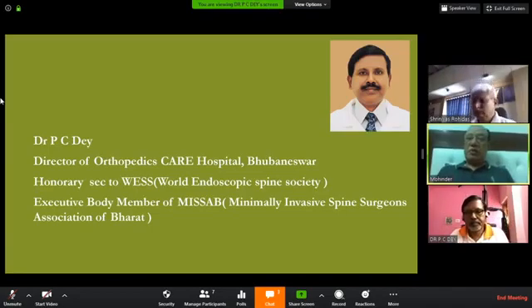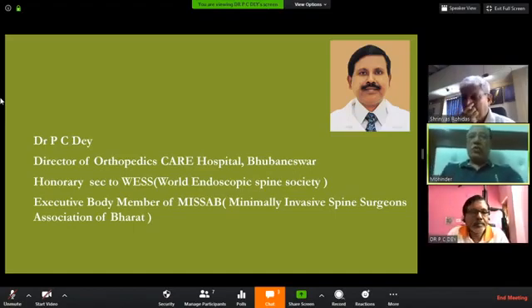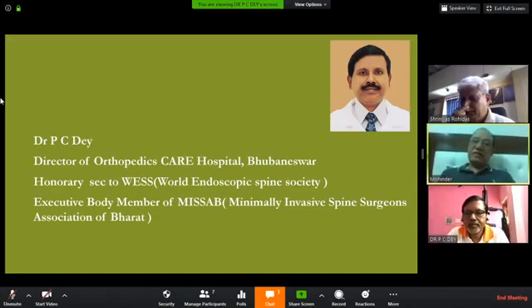First you buy a transforaminal system which is very costly. Then you switch over to interlaminar. So the message for the younger generation is that going for interlaminar system, master that technique, and it solves most of your problems. You really don't have to go in for a transforaminal system, to my mind, as far as surgical practice is concerned.